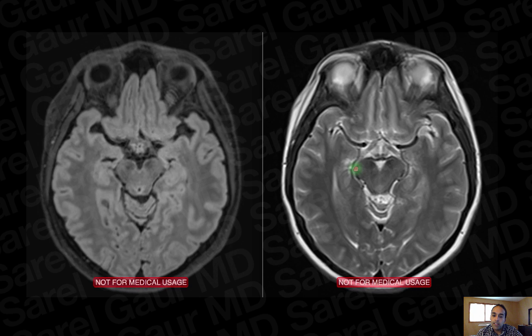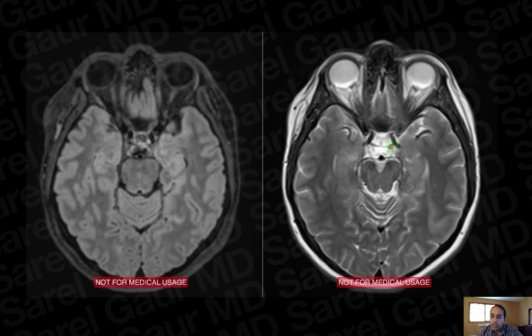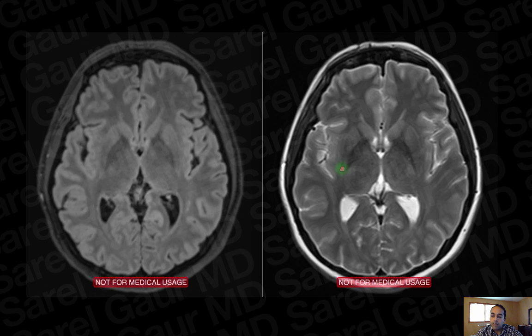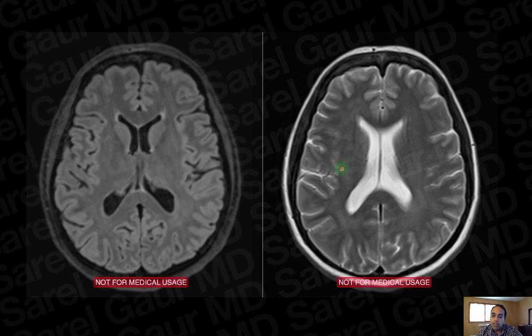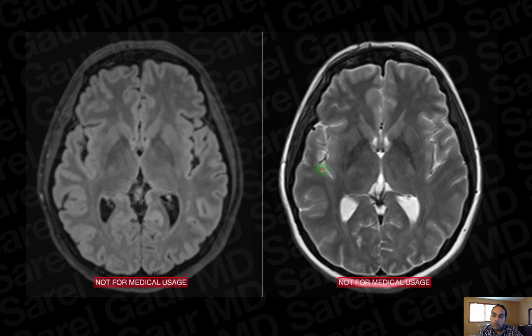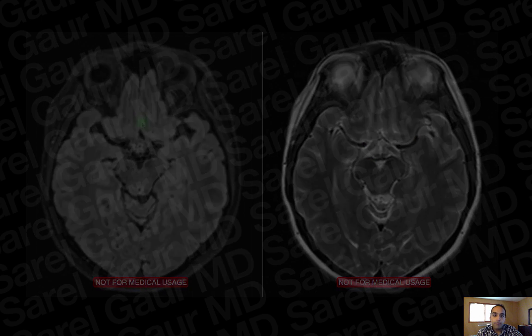So why do we still get a T2? T2 is helpful for looking at flow voids — here you can see the left MCA and right MCA. The major use for T2-weighted images is to confirm an abnormality seen on FLAIR and also to evaluate flow voids to see if they're obstructed, for example in a stroke.